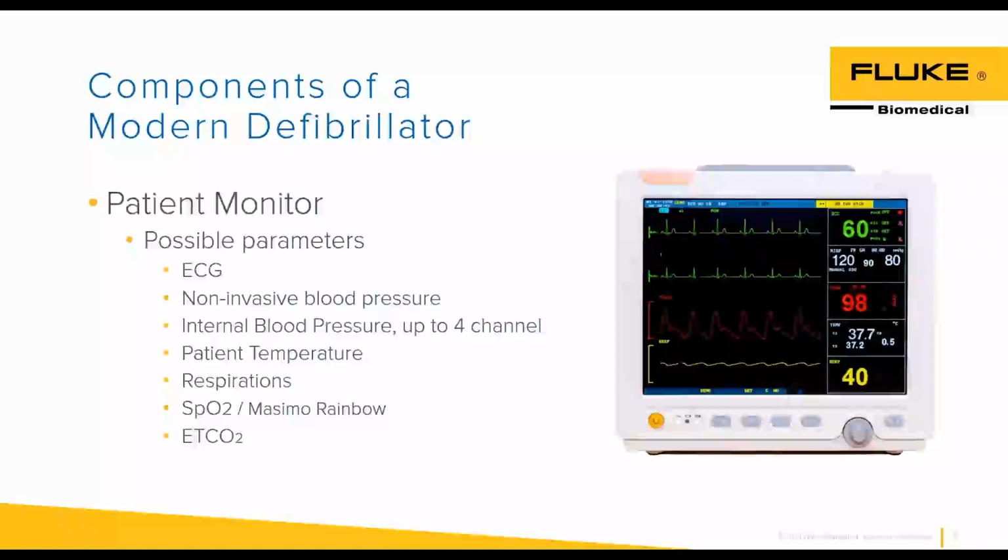So just keep in mind when you're doing your maintenance or looking at your inventory that if your devices have those capabilities, you'll need a patient simulator tool that can handle that Masimo Rainbow SpO2 lead.